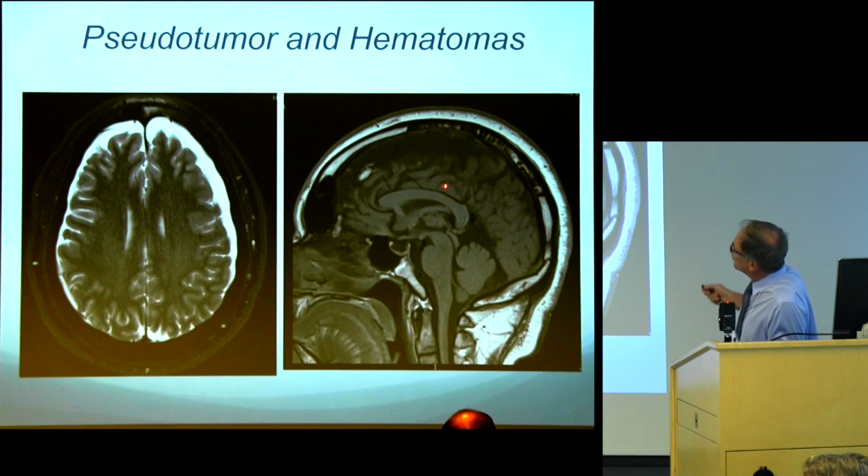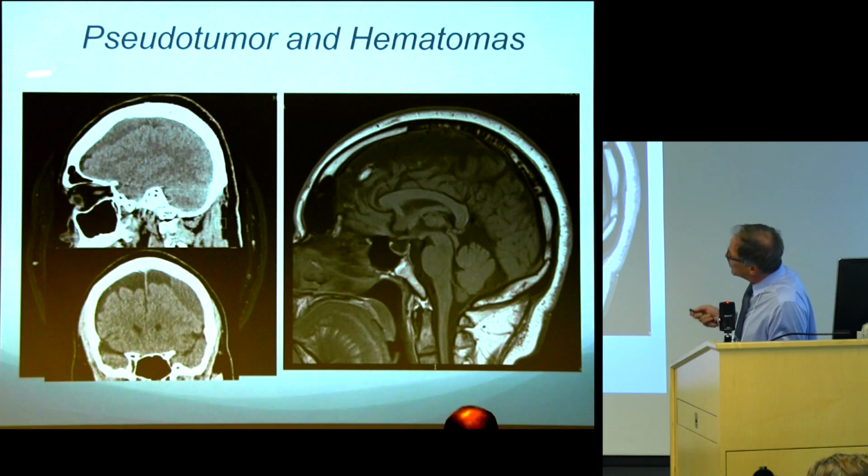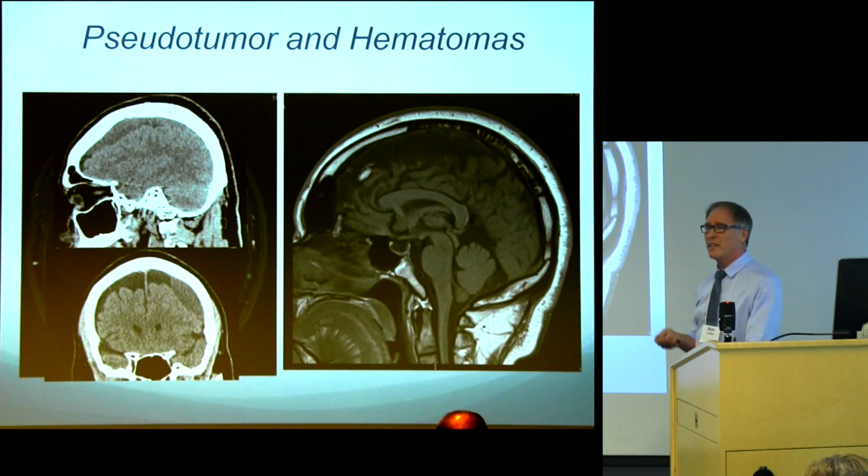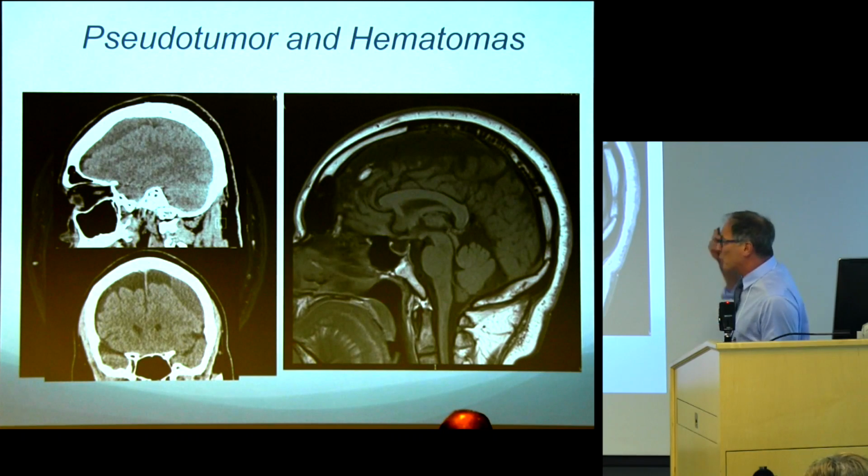So we see indication of pressure probably from the subdural hygromas, which eventually, of course, also evolved into subdural hematomas on both sides. So here's a person who had high pressure, had a sudden event of some kind, which could have been the bleed, actually. Well, the bleed actually occurred afterwards, so it wasn't exactly the bleed, but he had a severe pain in the back, has a situation which looks like low pressure, CSF leaks, as well. So we have probably some sort of mixed problem.